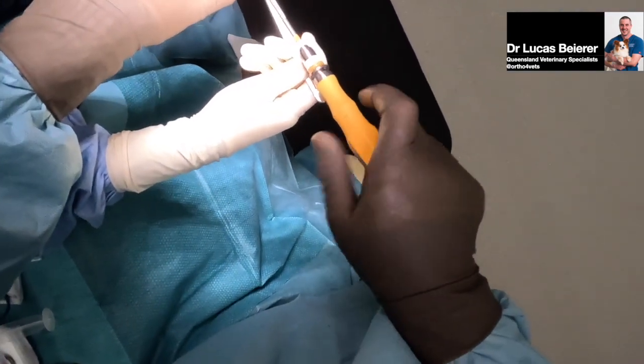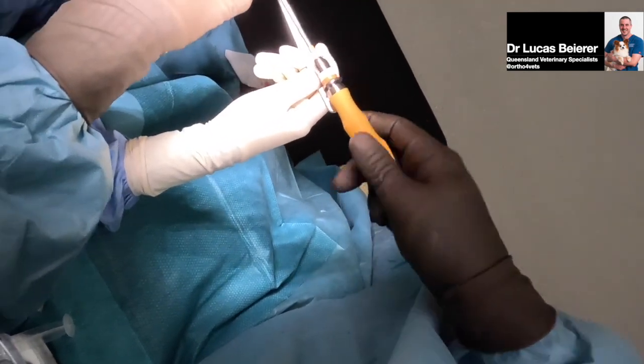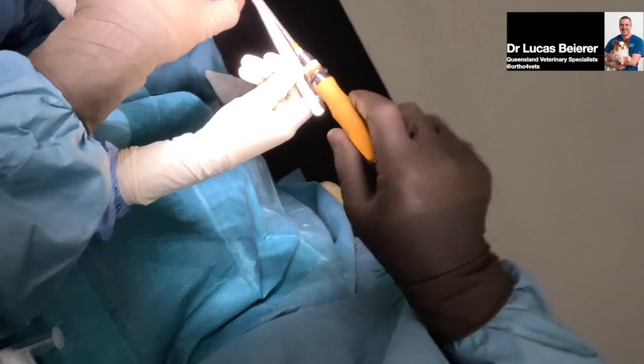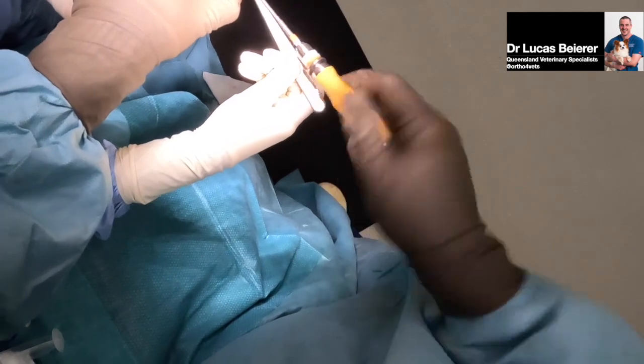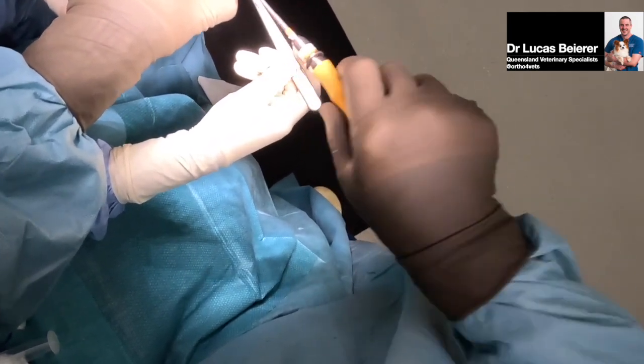What's this guy weigh? 28 kilos. Yeah, so he's not a big greyhound, he's only 28 kilos. So when these are really highly comminuted, sometimes you can place a bone plate buttressing, but it becomes a great logistical challenge with the soft tissues at that point.